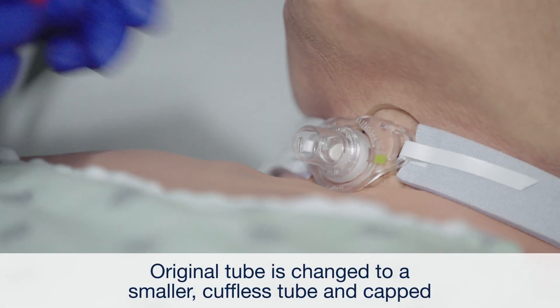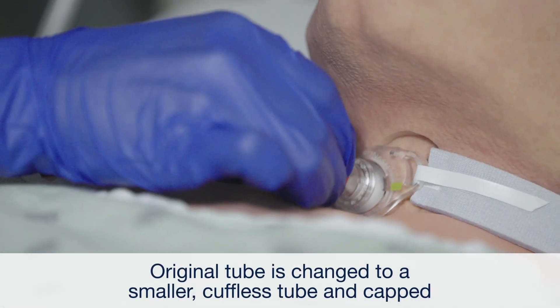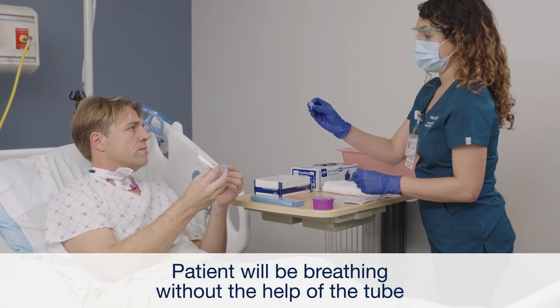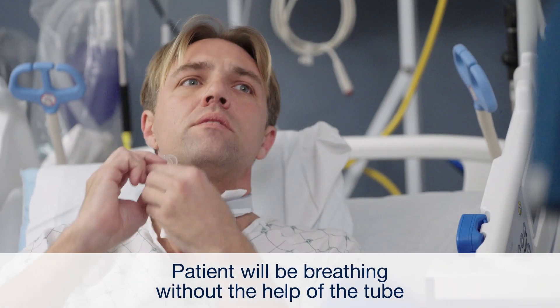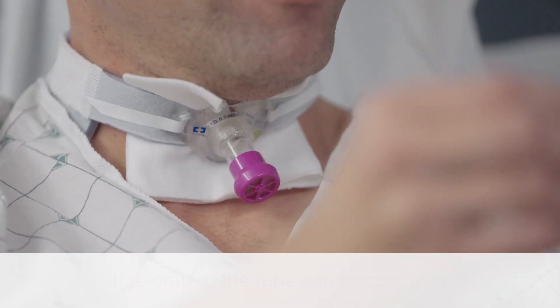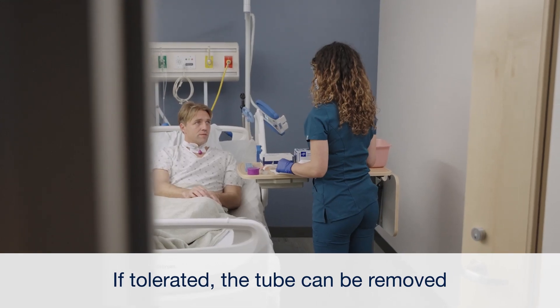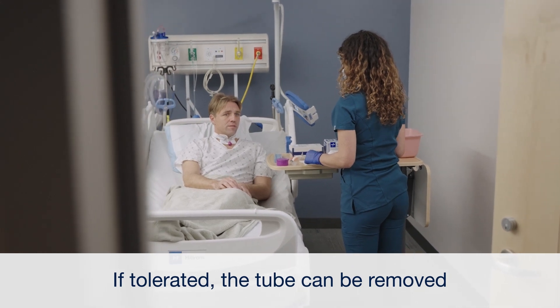The original tube is changed to a smaller cuffless tube and capped. This is a trial period where the patient will be breathing through their mouth and nose without the help of the tube. If the patient can tolerate the capped trach for a period of time designated by the care team, the tube can be removed.